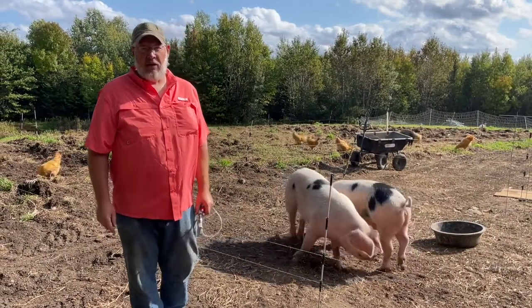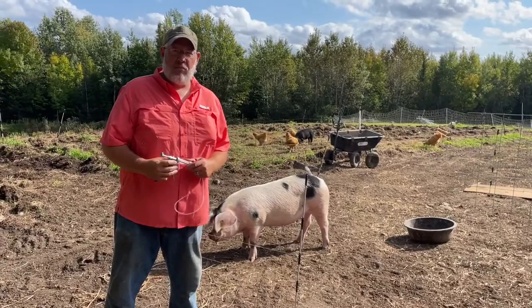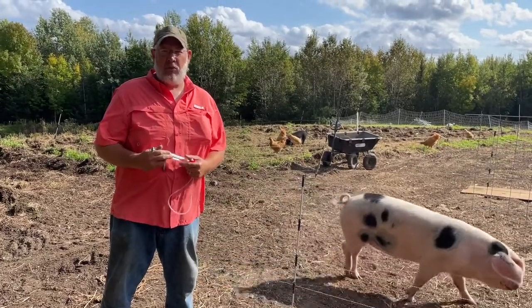Hey, this is Al Tilton from Tilton's Heritage Pastures. We're out in the field today. Pretty soon we're going to be giving our pigs some shots. I just wanted to cover some basic equipment that we use to give our pigs shots to make life a little bit easier.